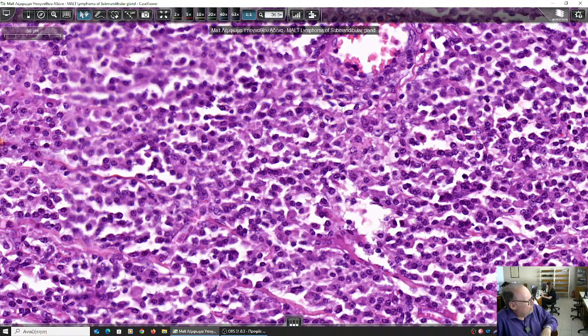However, if these normal appearing, but quite dense and monotonous B cells are lymphomatous, having a look at this specific site of that clonal proliferation of that lymphoma, could you tell me, without immunohistochemistry, if it would be of B or T cell origin and why?